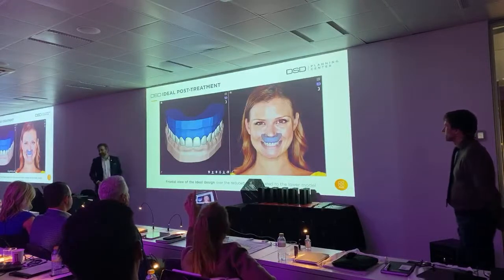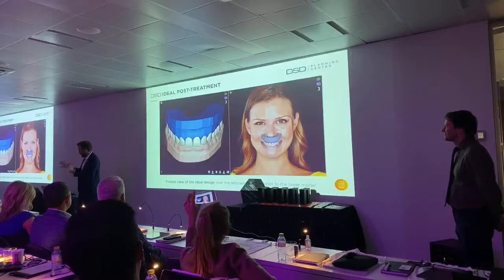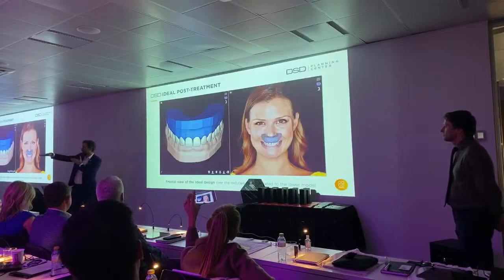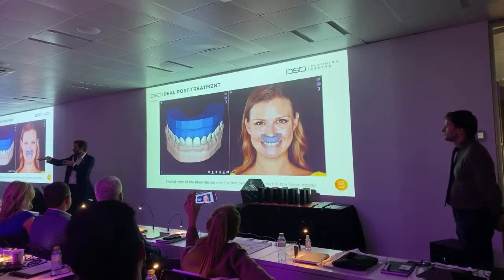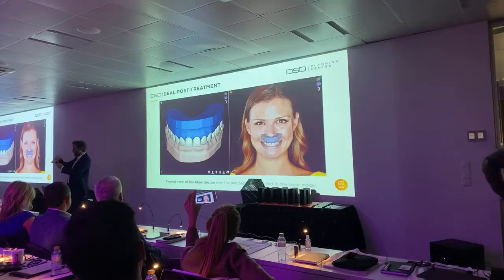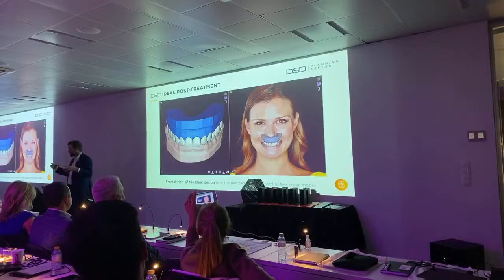On ortho cases especially, the transparency tool is very messy. Some cases are clear, but many cases are a complete disaster in terms of how you see them, because many times you have teeth sticking out. So you have two models, because you have to show the pink model, the blue model, and the design, and you have to play with the transparencies to show everything. I can tell you, it's a mess.